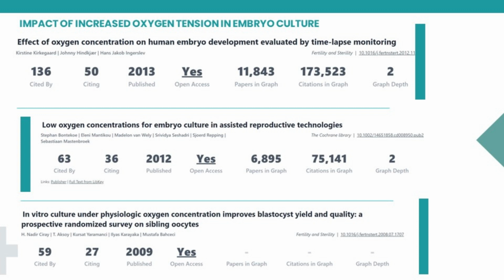Just because blastocyst develops in a box incubator and looks good does not mean that all is okay with it. The epigenetic signature of blastocyst and gene expression is impacted due to the oxidative stress, and the impact of these changes might not even be evident immediately or antenatally.